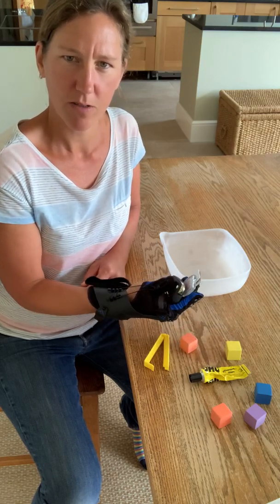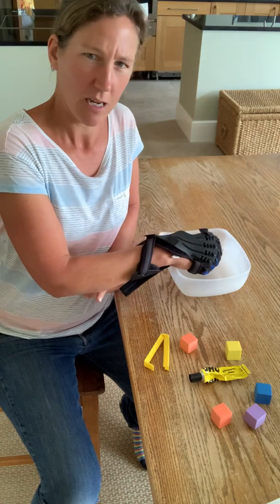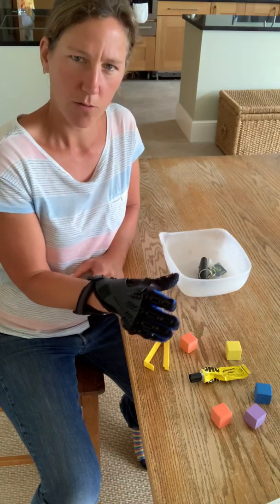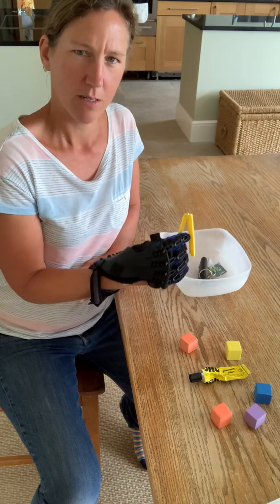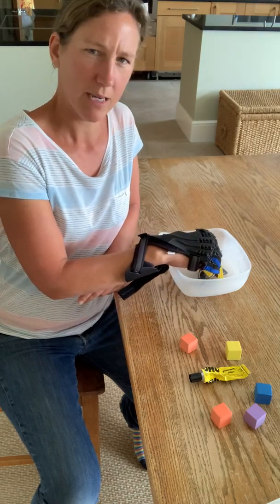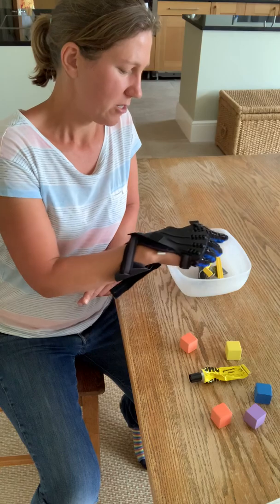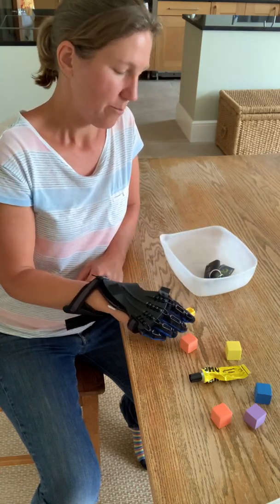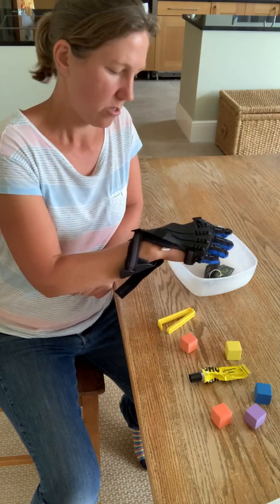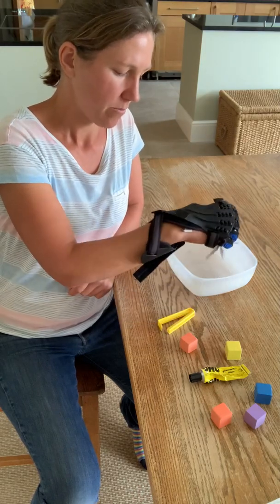them in the grasp. So I've got a set of keys and then just dropping them into a bowl. I've got a bag clip that I've got to manipulate and drop in. It also makes it challenging to try and fish the objects out of the bowl and being specific with which one you're trying to get out.